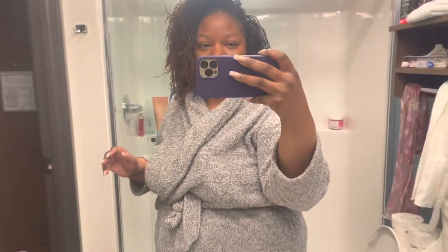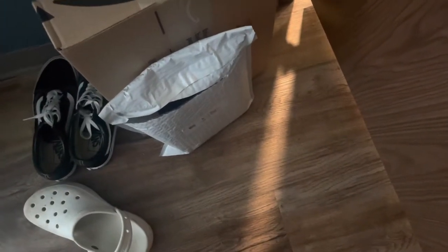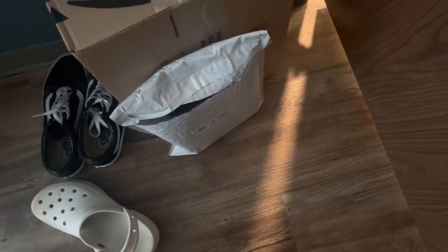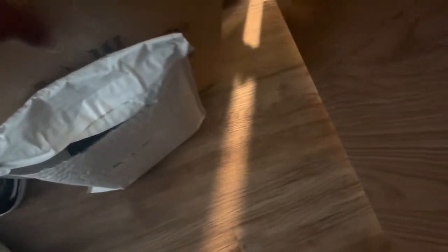Anyway, I have some packages. This first package is actually a collab — a partnership — and I'm excited to tell y'all about that soon. And then this is my scale, so we're gonna open this together.